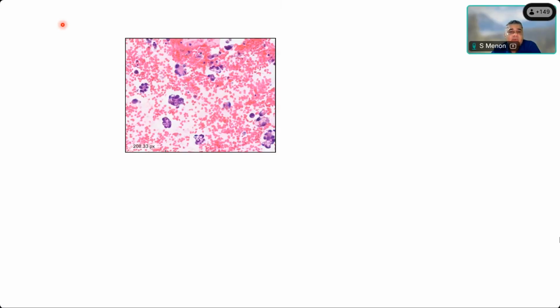That's very, very important. In a young patient, a 20-year-old, these cells might represent a yolk sac tumor actually, or an embryonal carcinoma, or even a very bad looking, strange looking or degenerated seminoma. So please look at the age. Just don't blindly call anything adenocarcinoma in a fluid. In a 59-year-old with ovarian neoplasm, definitely you can call this metastatic adenocarcinoma.